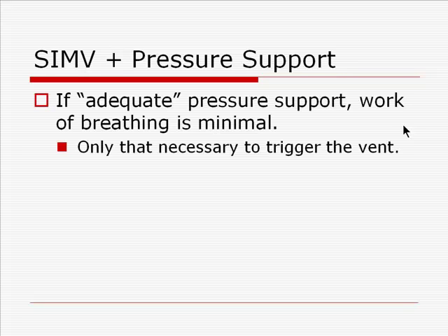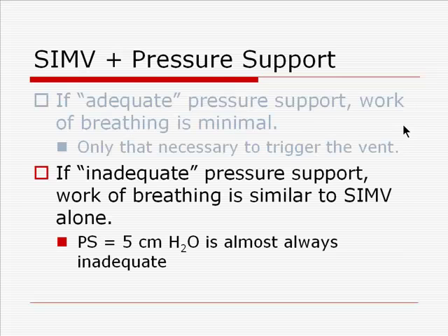When used in combination, SIMV plus pressure support can rest the patient if one uses an adequate or relatively high level of pressure support. However, if one chooses a low level of pressure support, the work of breathing may be almost as high as if one were using SIMV alone.